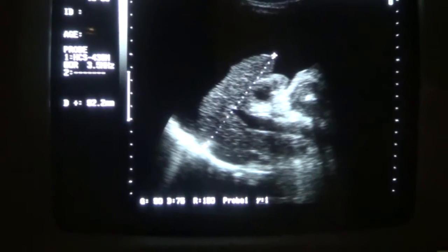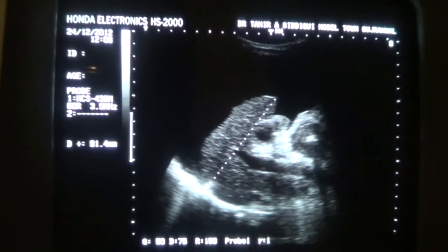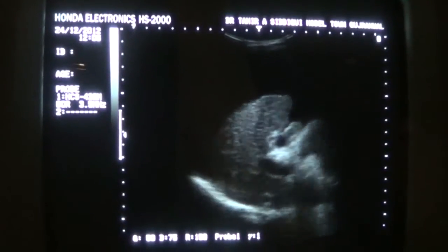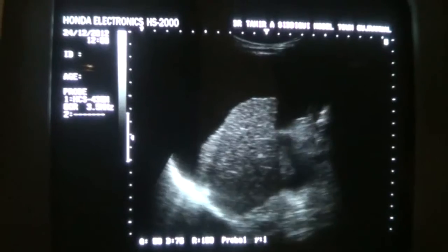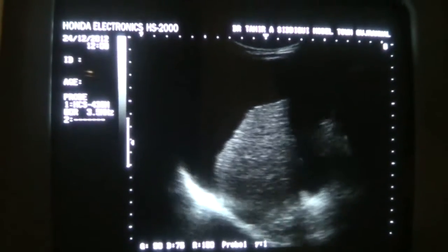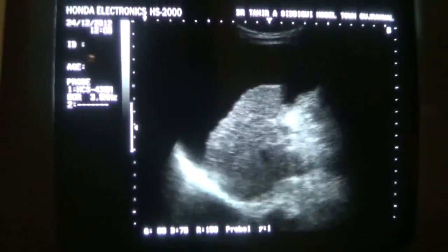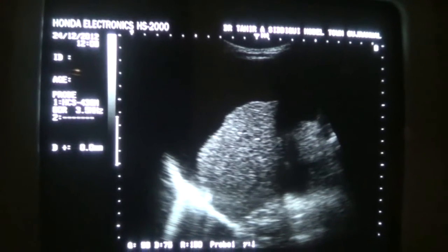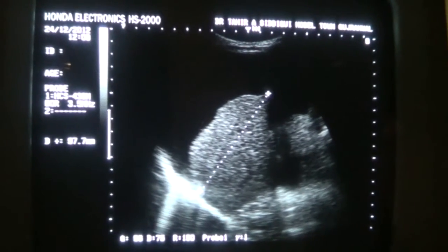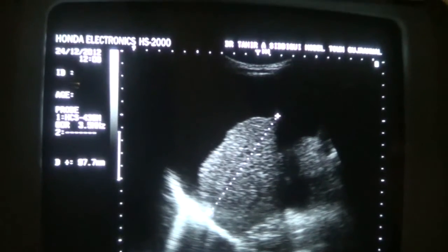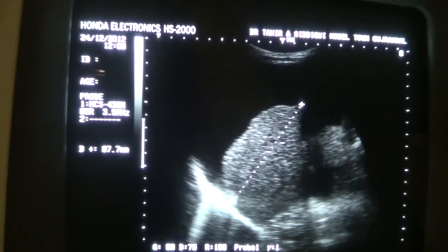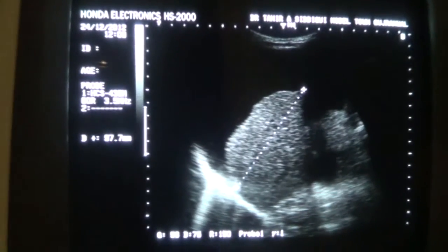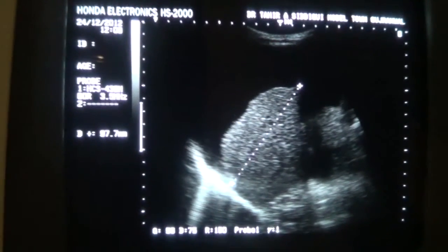Only the shrunken liver can be measured in total by real mode. This is the only case where you can give the measurement of the liver in centimetres or millimetres. The total span of the liver measures 9.77 centimetres. The normal minimum is 12 centimetres, so this liver at 9.7 centimetres is shrunken.